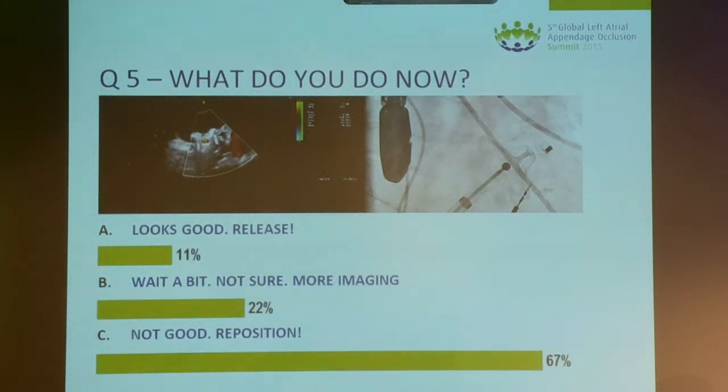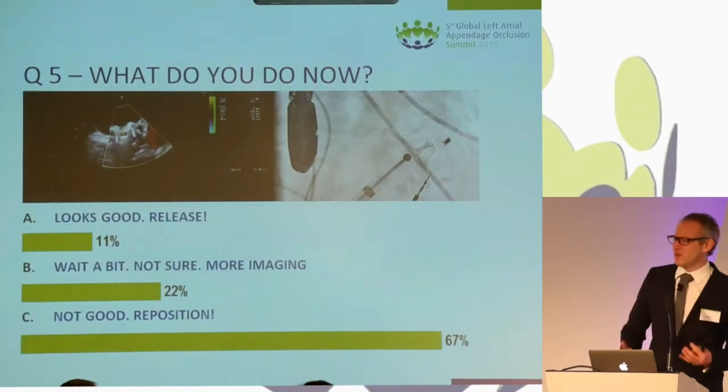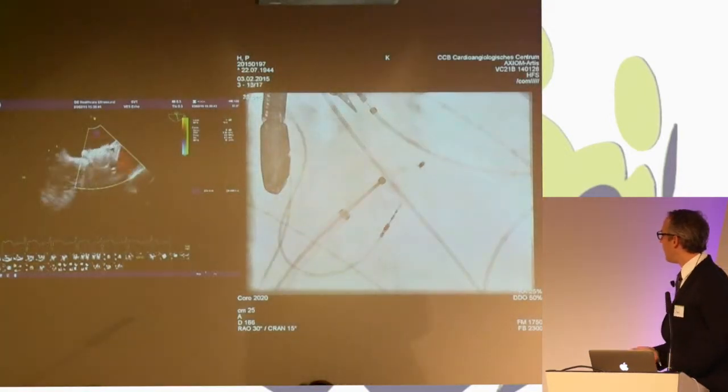Oh my God, you're giving me a hard time. Okay, 11% think it's good, 22% want to wait a bit and do more imaging, and 2/3 don't like the position. Yeah, we didn't like it either, although it might be okay, but we felt, let's try to do a little better. And so we took the same decision as you did.